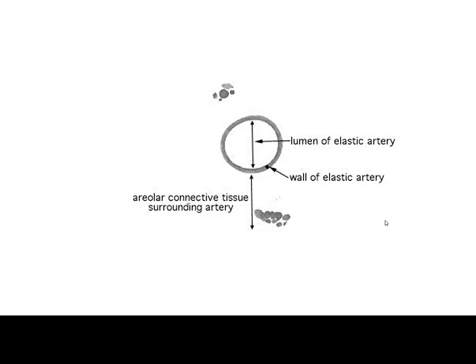All right, different stain, looking at blood vessels. Follow this inset as we get higher and higher. This is going to be a low magnification view, as you can see, of an elastic artery. So we're going to expect to see a number of layers, intermixed layers of smooth muscle, elastic lamina, smooth muscle, elastic lamina. And as we look at the inset, that's exactly what we see.